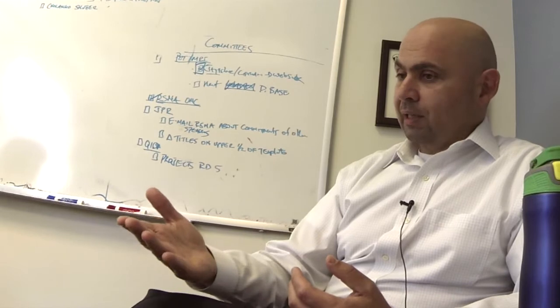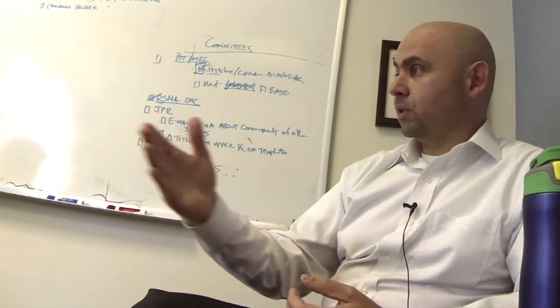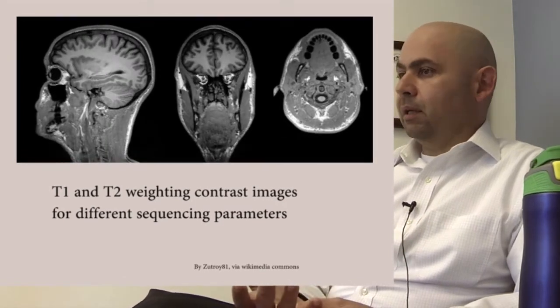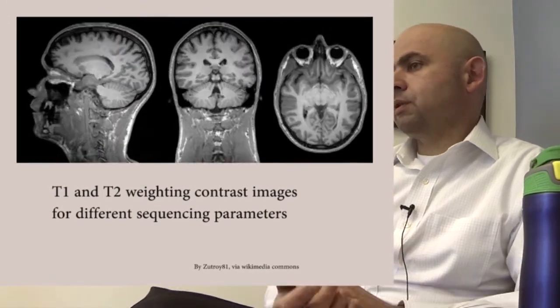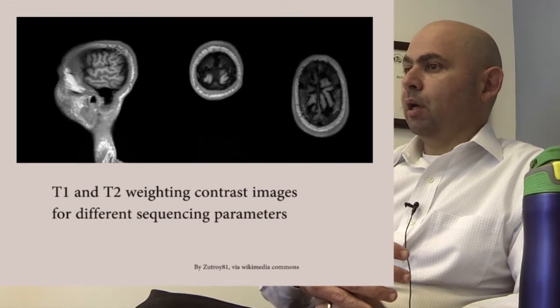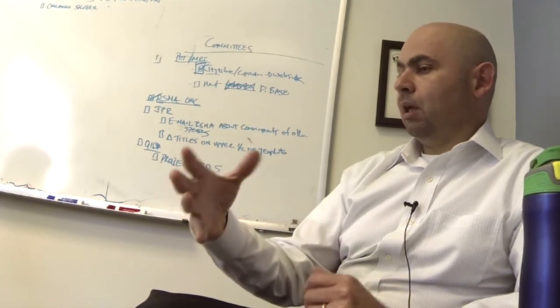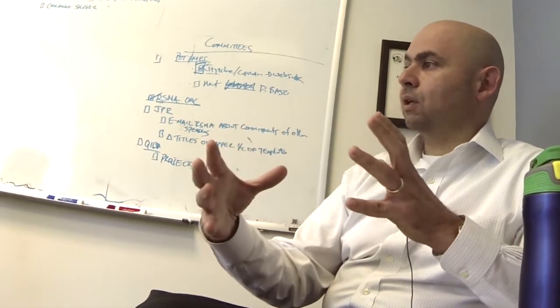So you have all of these relaxation properties, and going back to the experiment that we talked about, in the pulse sequences you can vary either the repetition rate or the other factors to weight an image to differences in the relaxation rate. For instance, free water will have a different T2 than fat, than bone marrow, than myelin, and therefore you can heavily weight an image, meaning that you can make the contrast most specific to that property.